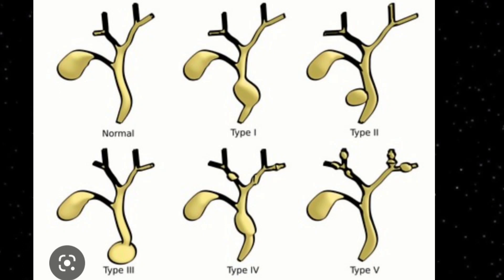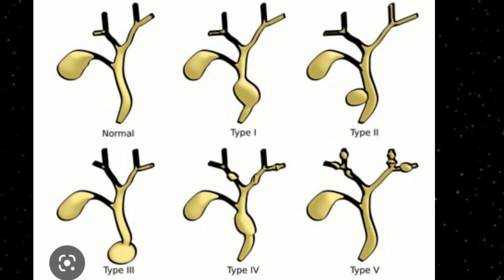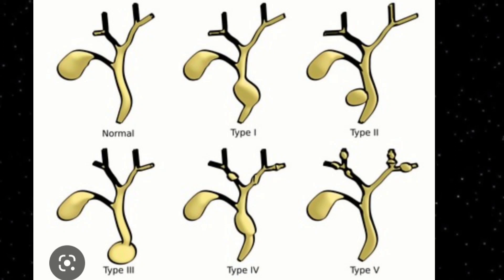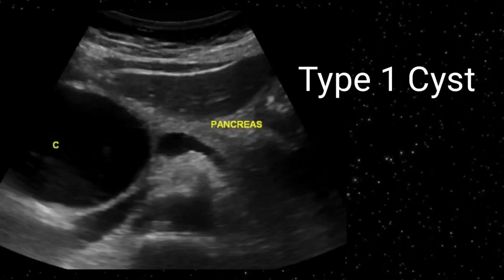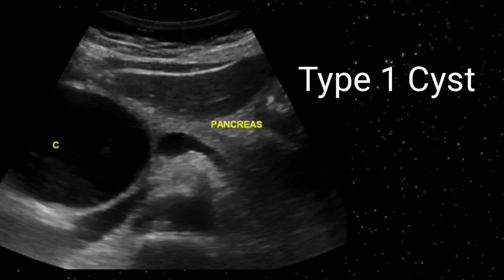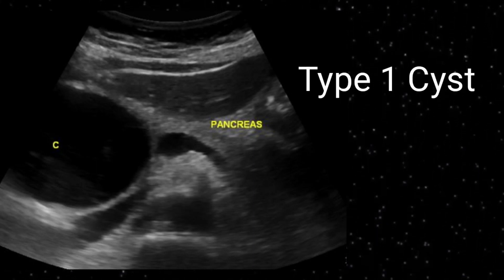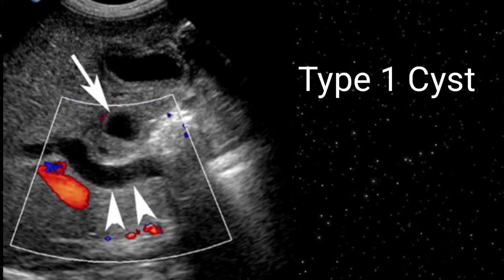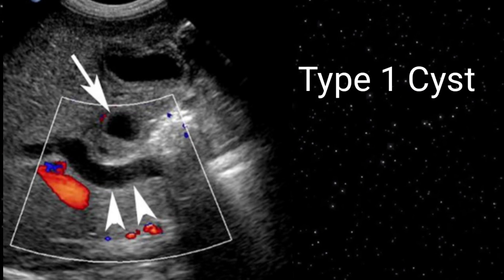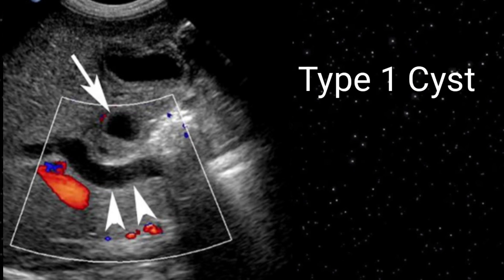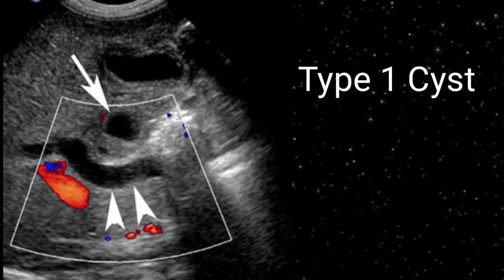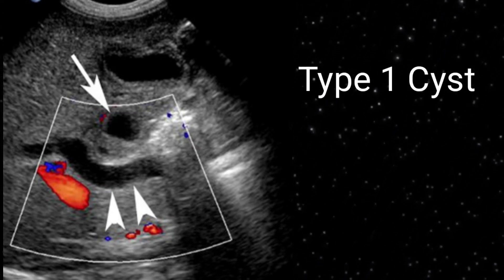Type 4 shows multiple intrahepatic and extrahepatic biliary dilatation. Type 5 is also called Caroli disease and consists of multiple intrahepatic biliary dilatations. On ultrasound images, choledochal cyst Type 1 will appear as a big simple cyst in the proximity of the CBD with a clear margin — a fusiform dilatation of the CBD. You can appreciate the CBD, and with color flow you can see the artery; above it you can see a clear small cyst, which is a Type 1 choledochal cyst. It may appear small or large in size — whatever you find, mention it on the report.